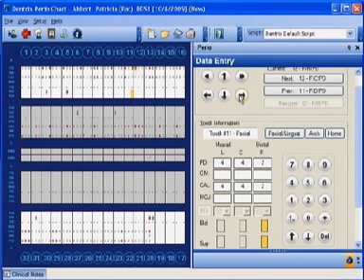And you can do this throughout the mouth, and when you go to save it, it asks to save all. You've created a whole new perio chart, still saving the last chart exactly as it was. You can't change the last one. You've just updated today's date, and it saved the whole thing as today's date. You can find your paths that work best for you.